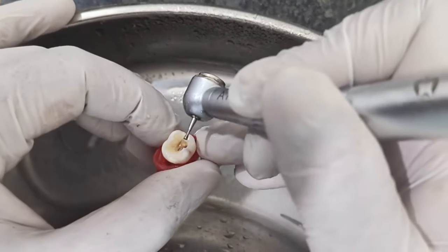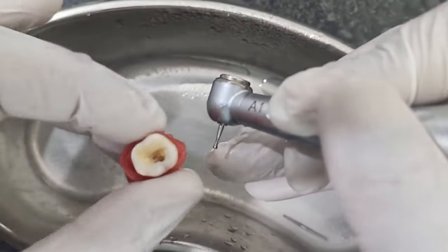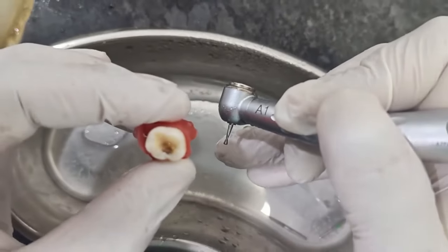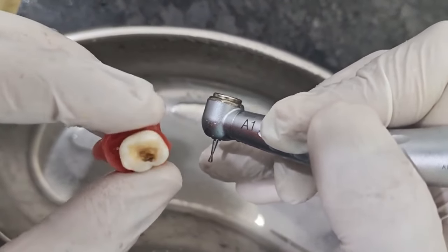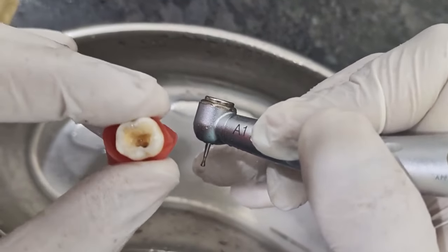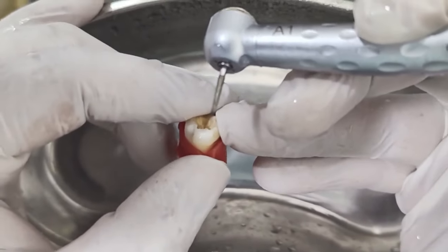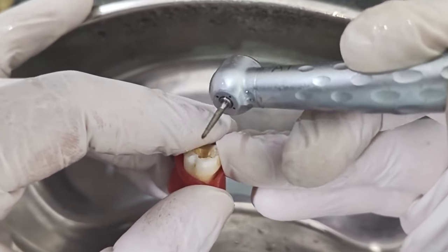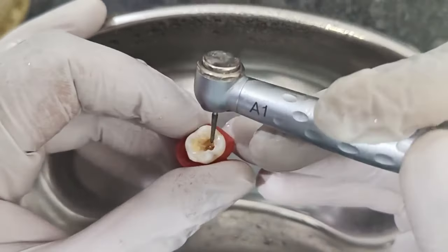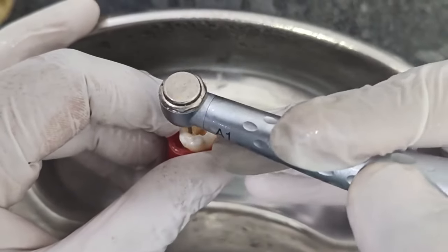Next we will use the EX24 burr, which I had shown in the previous video. This is the carious lesion. Still I need to remove some more. This is the EX24 burr, and the tip is a non-cutting tip. You can see there are no diamond points in the tip. So I will just put it inside and rotate the burr in all the directions.